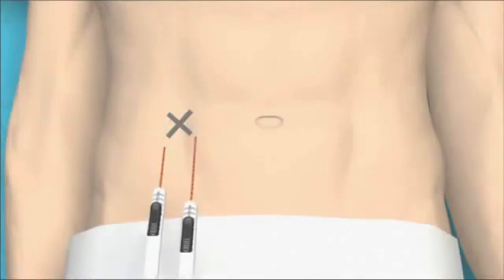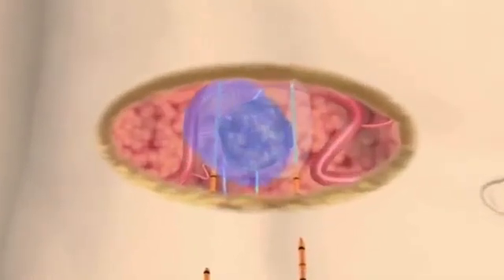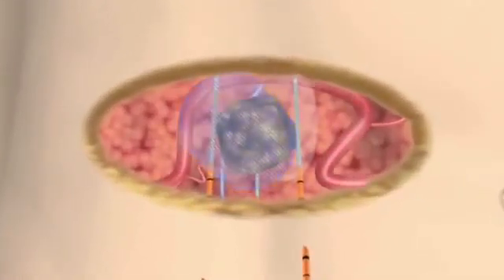A NanoKnife IRE treatment consists of a series of 90 extremely short electrical pulses, each less than one hundred millionths of a second. Cell death is induced within seconds and the patient can often be released from the hospital the same day.